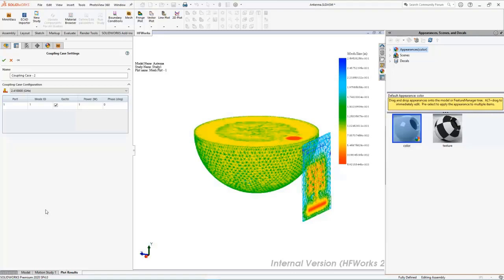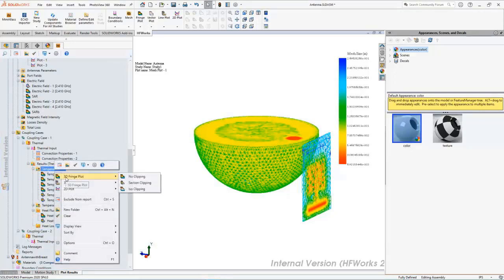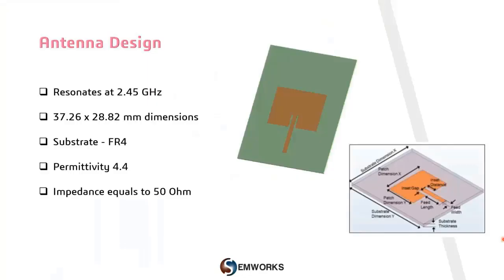So, in addition to the plethora of electrical and electronic design parameters, you can also obtain the temperature gradient and heat flux of your design due to the conductor and dielectric losses. And now we are going to check the results obtained after simulation.